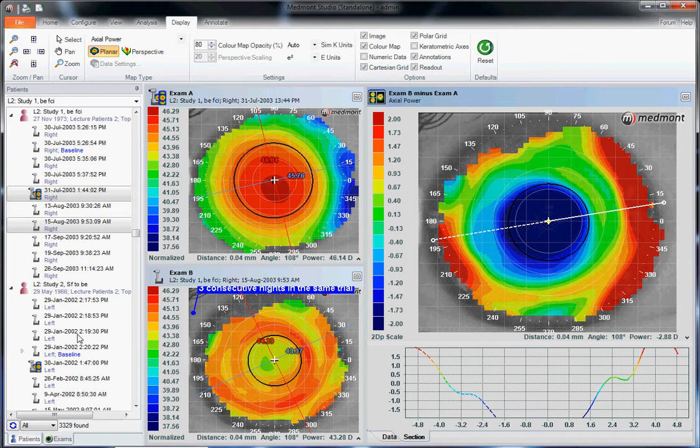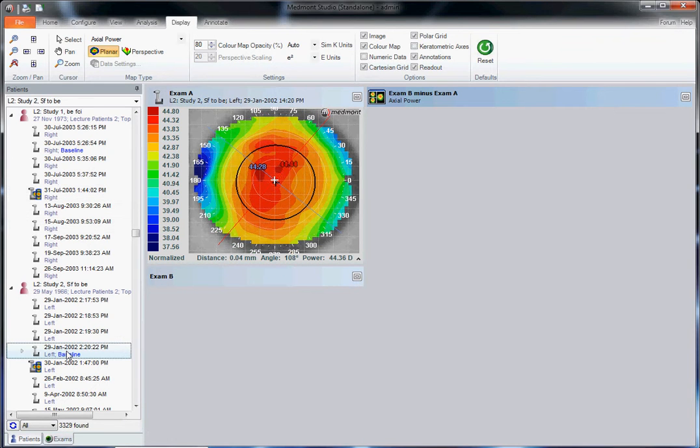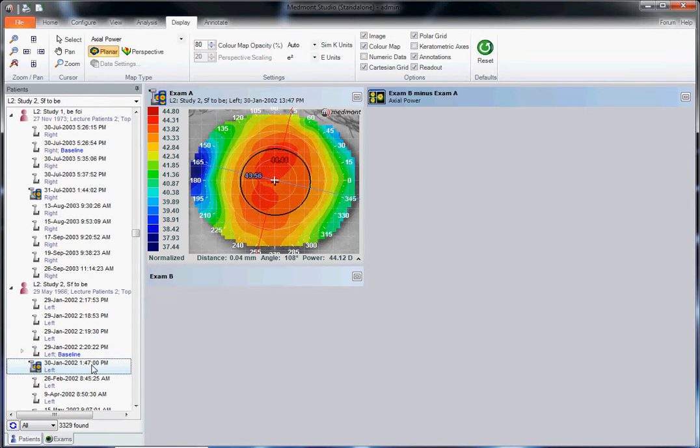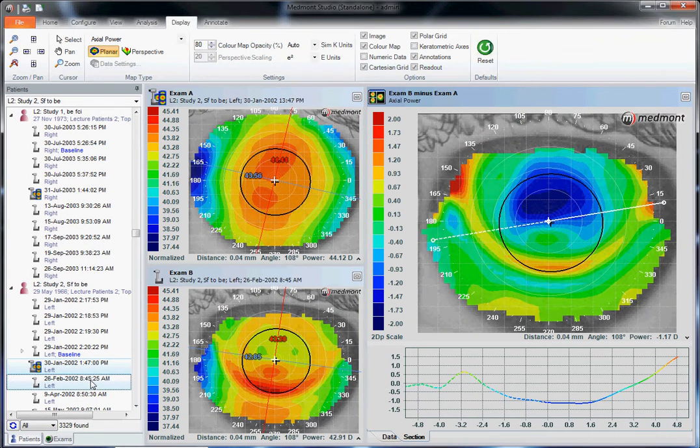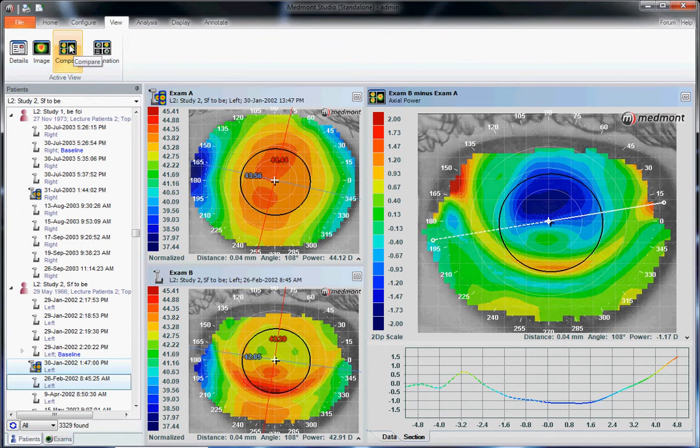If we were to choose a different case, we can choose our baseline, our best baseline map, or ideally we would do a composite to get a little more corneal coverage. Hold down the control key, select our post-treatment topography, then again go to view to select your comparison map or your subtracted map.